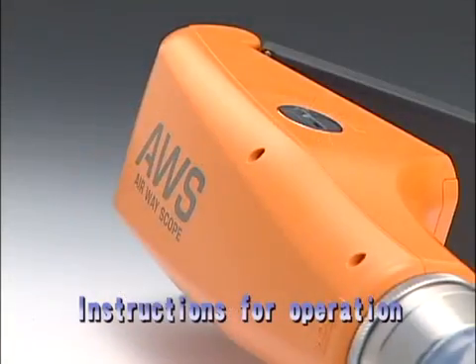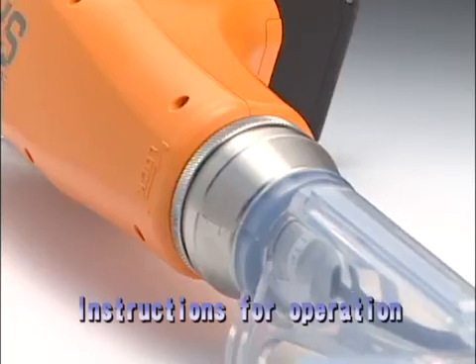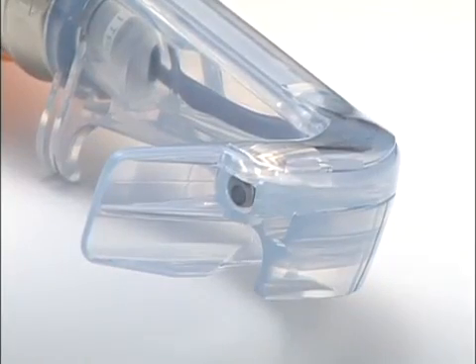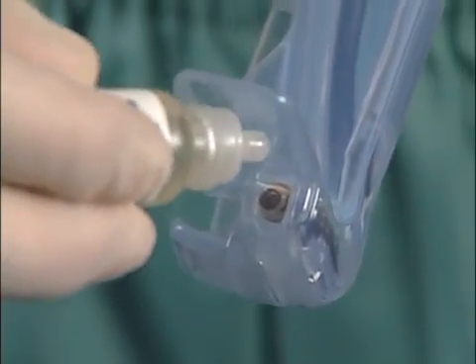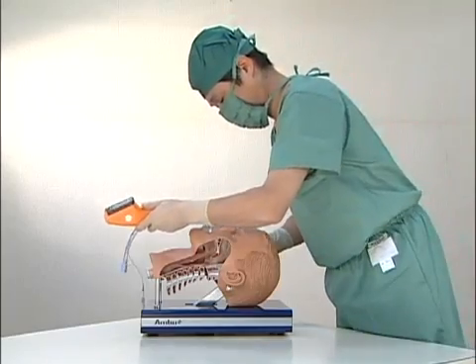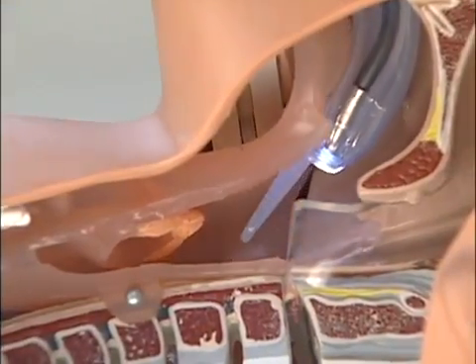Because its mechanics differ from conventional laryngoscopes, the video laryngoscope Pentax AWS is operated slightly differently. First, you must place a medical defogger on the scope window. When you intubate, watch closely and position the scope along the patient's palate without involving the tongue.